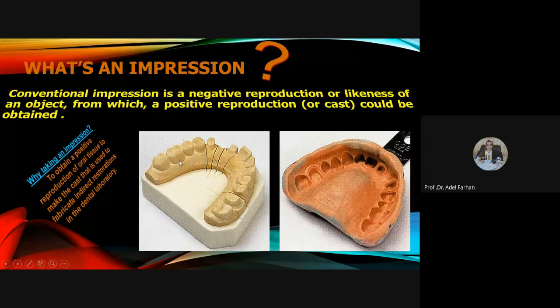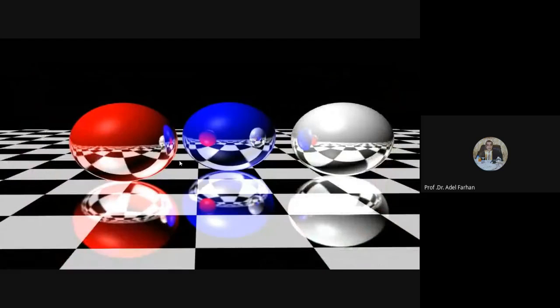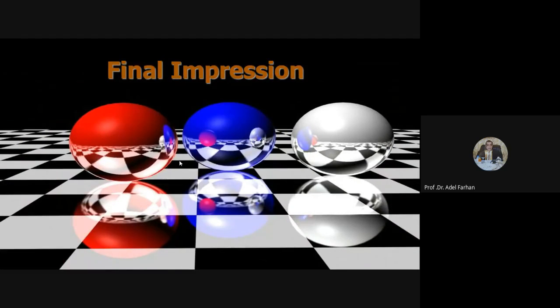Okay, to have impression طبعا we need manufacture. In order to have impression, you need, as you know, dental material, you need custom tray, and we need impression syringe. طبعا احنا نتكلم على final impression in fixed prosthodontics، يعني ما نتكلم بالبروستاتيك. فهذه الريكوايرمنت نحتاجها لما نجي ناخذ امبريشن بالكراون بريدج اللي هي امبريشن ماتيريال والكوستم تراي او سبيشال تراي والامبريشن سيرنج.